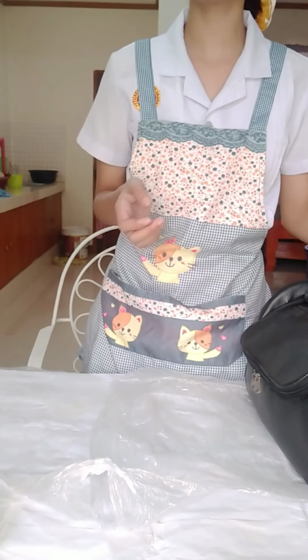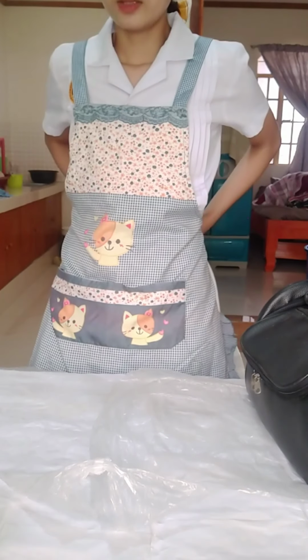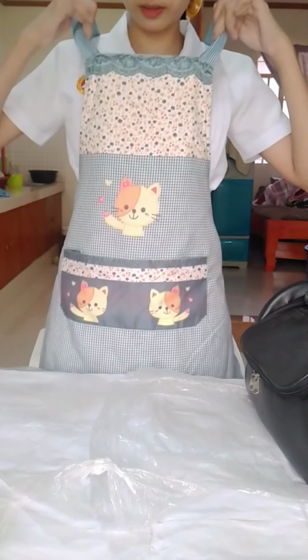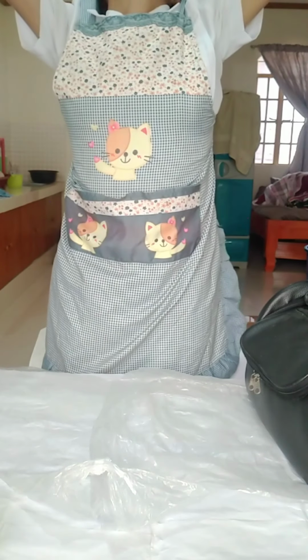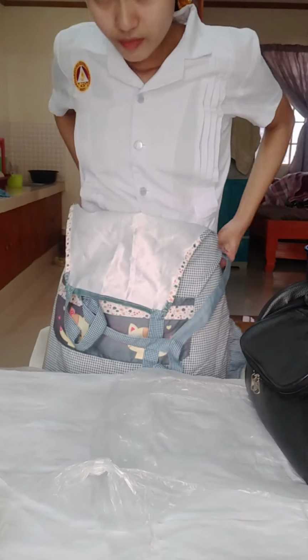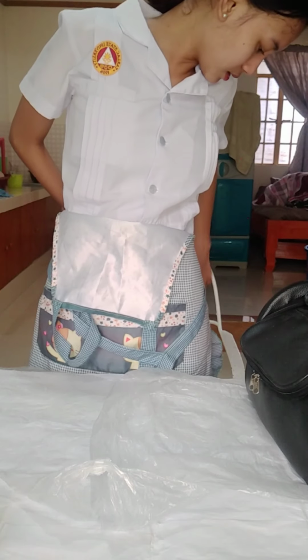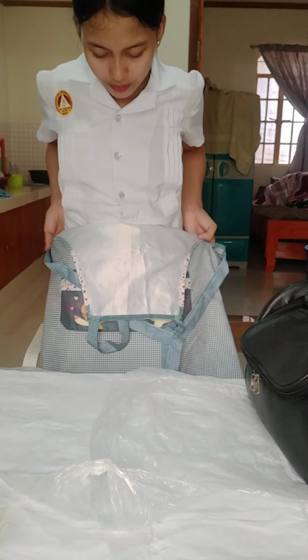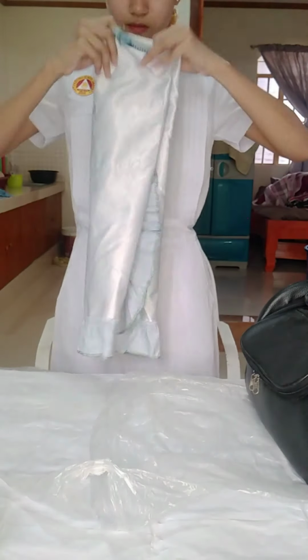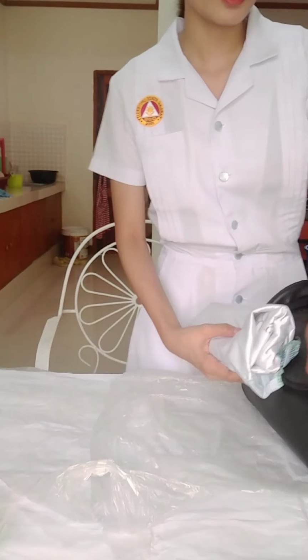And then after that, I'm going to remove my apron away from the body. So first, I'm going to remove it from my neck. And then second, from my hips. I will untie it. Then I will fold it like this. Then I will put it in my CHN bag.